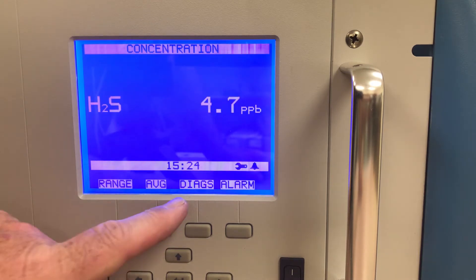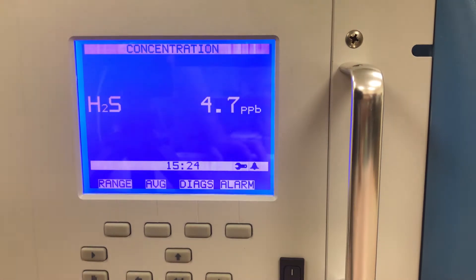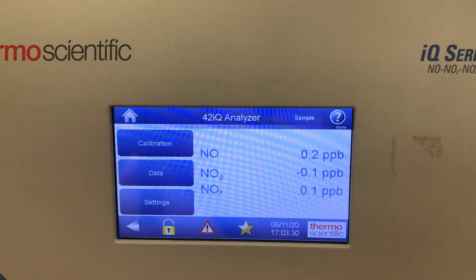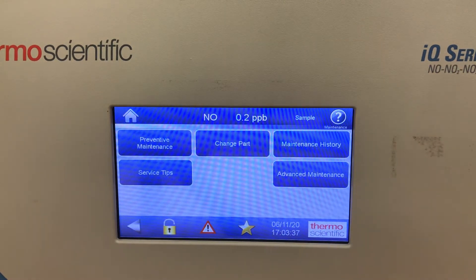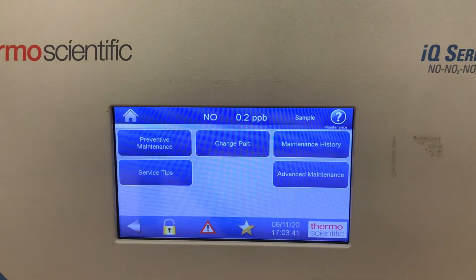So that's how I would watch for maintenance issues on the I-Series analyzer. If I go over and look at the IQ-Series analyzer, I can go into the alarms menu and there's a button called Maintenance. In here there's preventive maintenance, change part, maintenance history, and service tips.